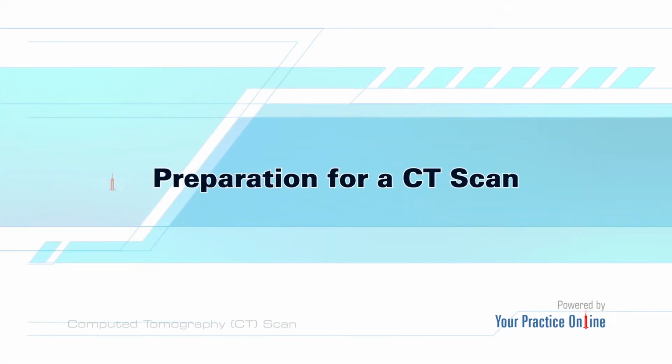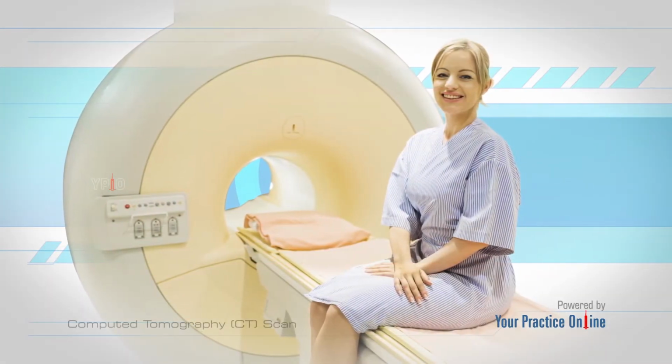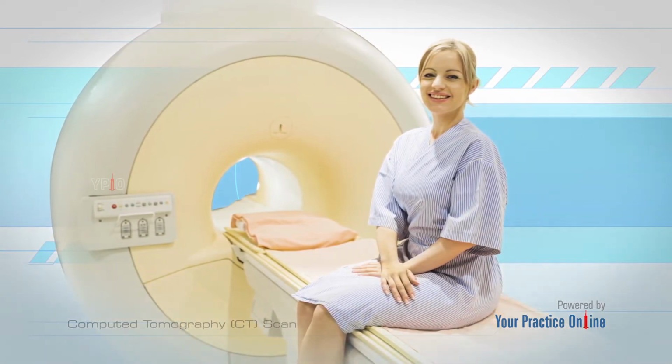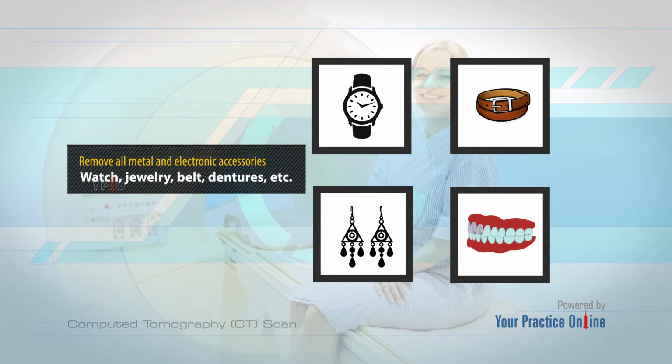Preparation for a CT scan. Preparation for a CT scan usually involves the following. You will be asked to change from your regular clothing into a hospital gown. All metal and electronic accessories like a watch, jewelry, belt, dentures, etc. should be removed, as metal in these objects might interfere with the CT scan.